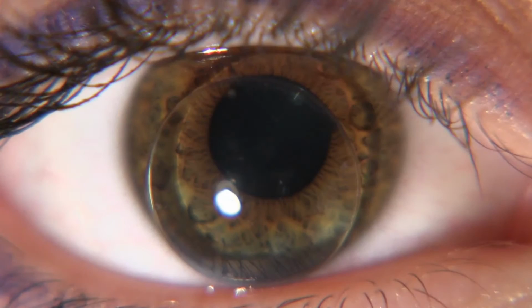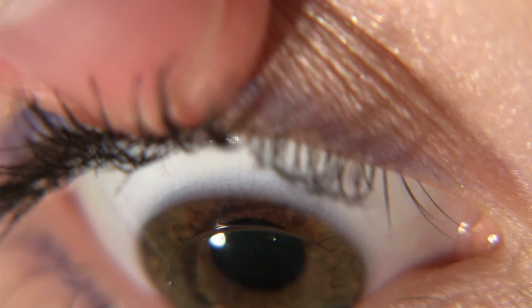Sometimes a patient will have troubles with their near vision. The first step in evaluating and troubleshooting the patient's near vision is to look at where the lower lid is sitting. If a patient has a low positioned lower lid and the lens is resting on the lower lid, when the patient looks down, they may not be able to translate far enough into the near optics of the lens. To rectify this situation, you'll want to increase the lens overall diameter to help move the segment height up closer to the pupil so that when the patient looks down, they can now get below the geometric center of the lens and into the near optics.